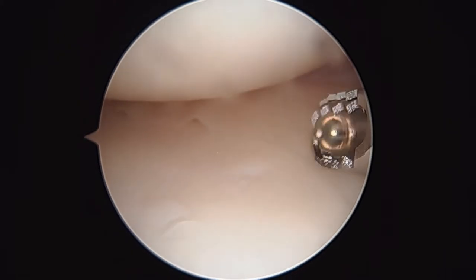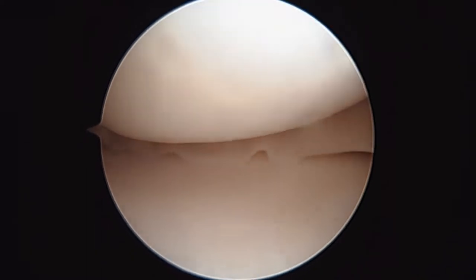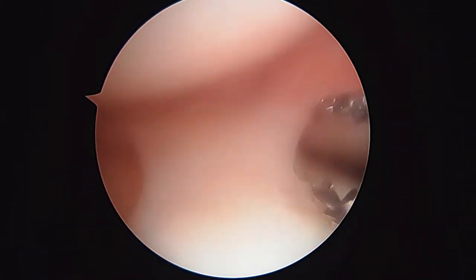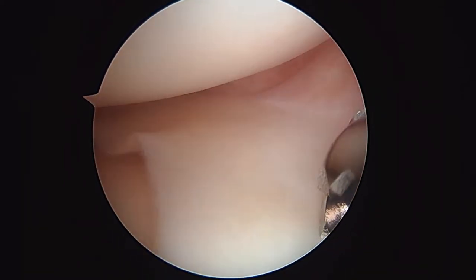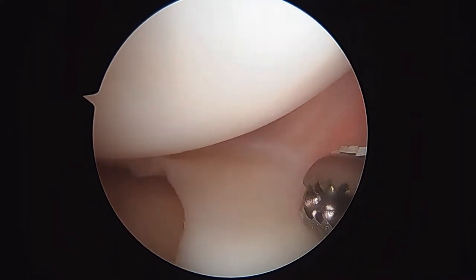Now we're looking in the medial compartment. I'm going to stop for a second because the scope looks a little loose — I'm just going to tighten up. So here in the medial compartment, here's the medial meniscus. You can see the capsule and the meniscal capsular junction, and the vascularity there in the capsule, and how it kind of stops when you hit the meniscus. There's still some that continues into the meniscus, but not all the way through.